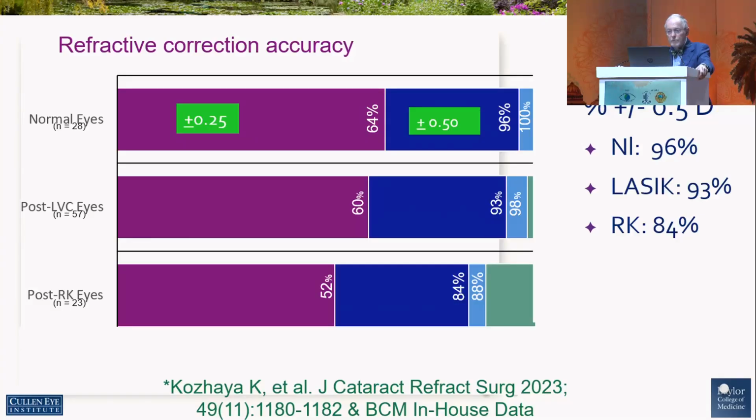So these are certainly far better than anything that we can get with our standard IOL calculations, but it's a lot of time and a lot of effort.